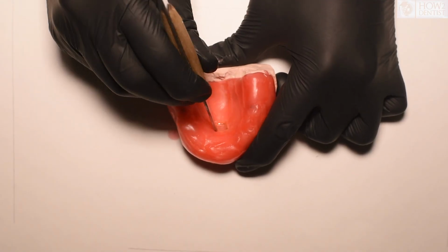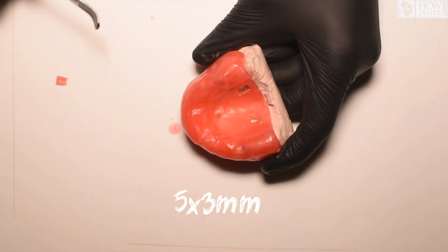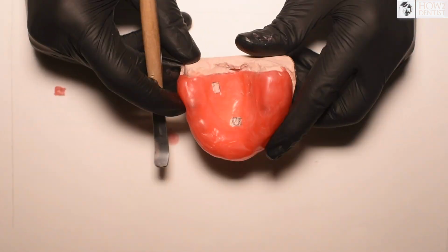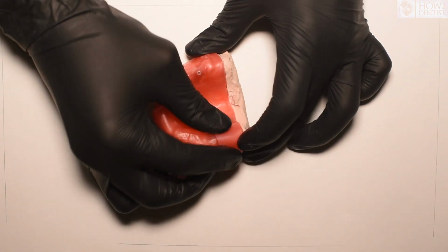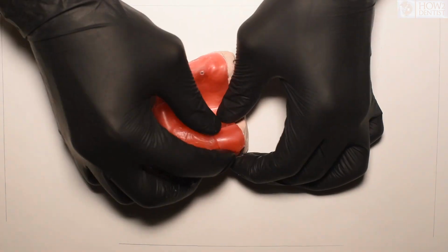Then we create holes in the wax for the stoppers with an area of approximately 5 mm by 3 mm and fill them with the tray material. This allows you to accurately position the tray. One of the mistakes is that the body of the tray is too close to the molars, especially if they are not visualized on the primary impression. Then it's better to additionally isolate this area with wax.